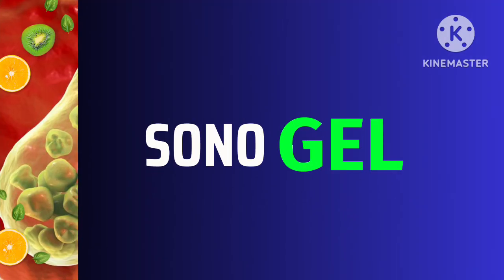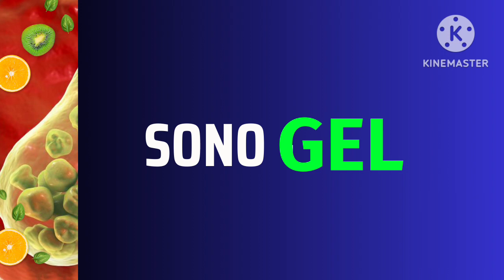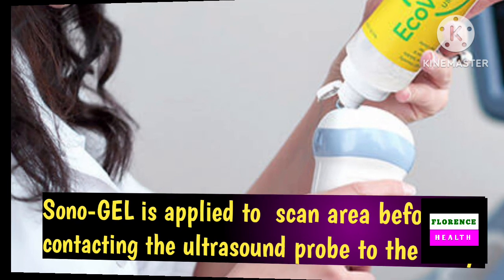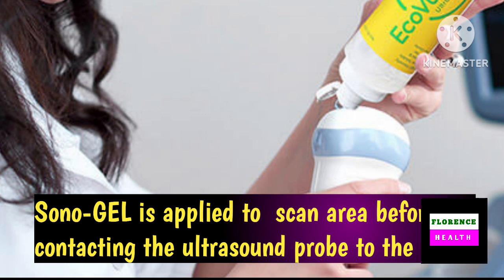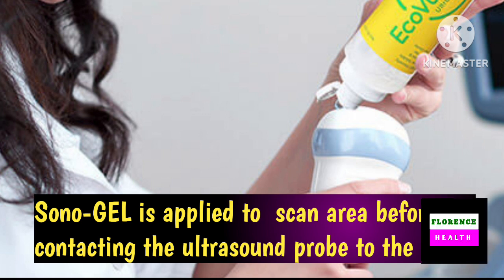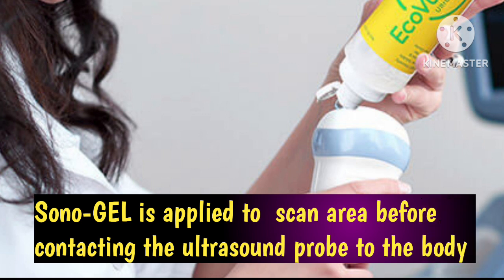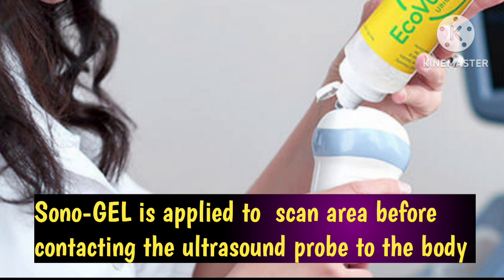Now discuss about the gel which is used during ultrasound examination. What is its composition, what is its property, and why it is used. Sono-gel is applied to the scan area before contacting the ultrasound probe to the patient body. Again I am telling, Sono-gel is applied to the scan area before contacting the probe to the patient body. But question is, why it is used?